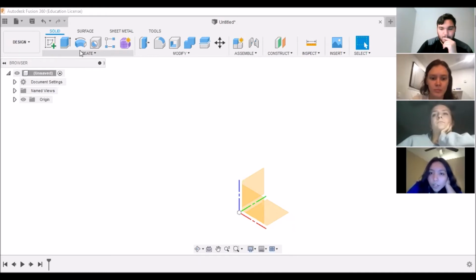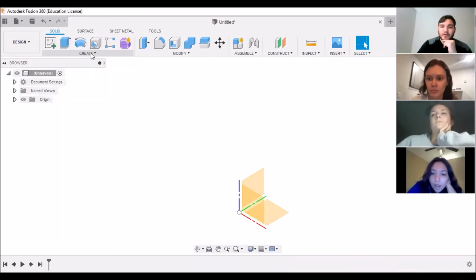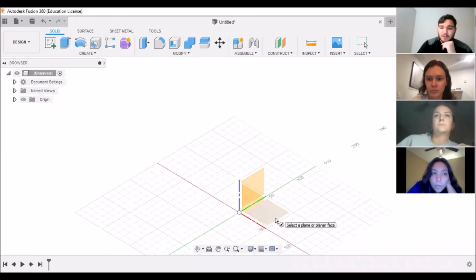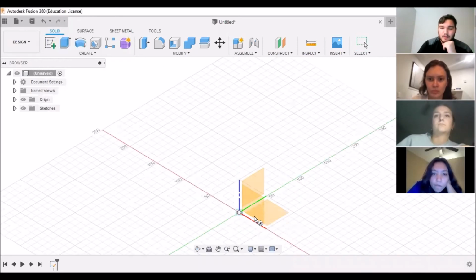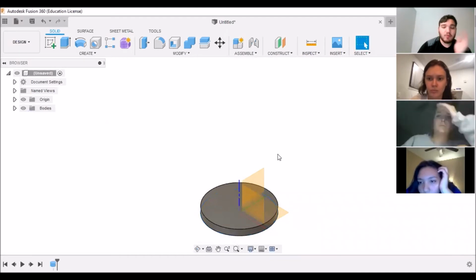Make the cylindrical base. So we can go down to the create. We can actually just hit cylinder this time. Sketch on the bottom plane. Same thing. Just do 100. Enter. And now you can scroll up and down immediately. Press OK. And boom, we got a little base.